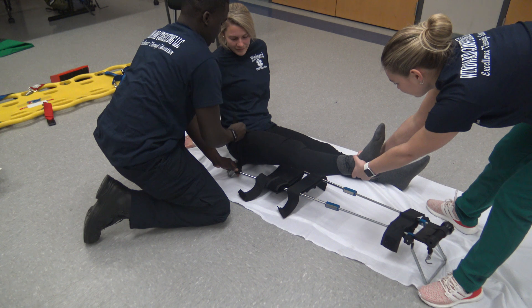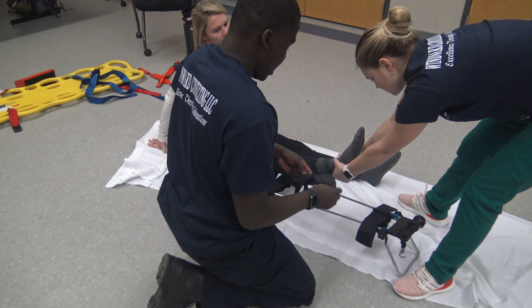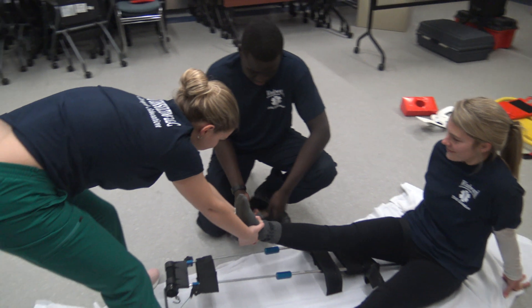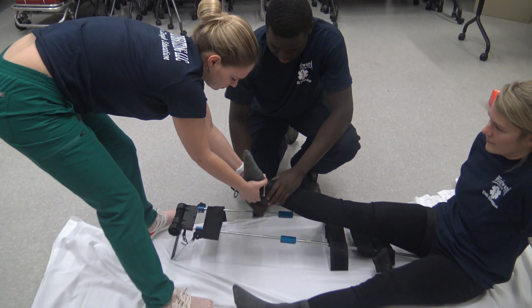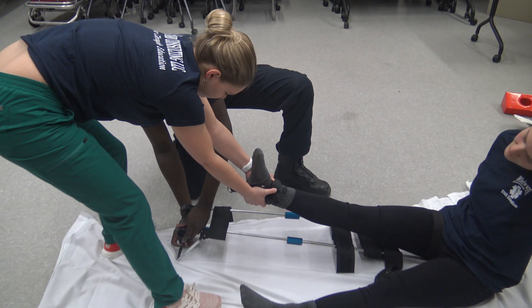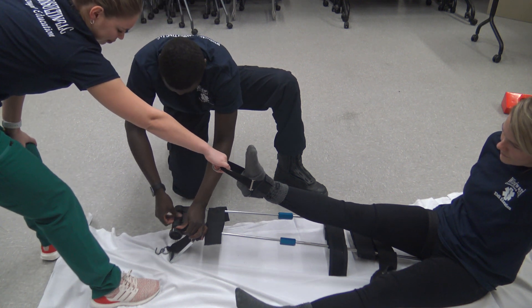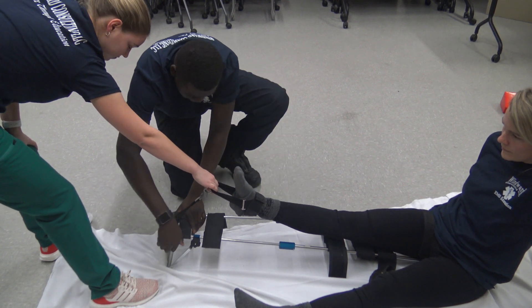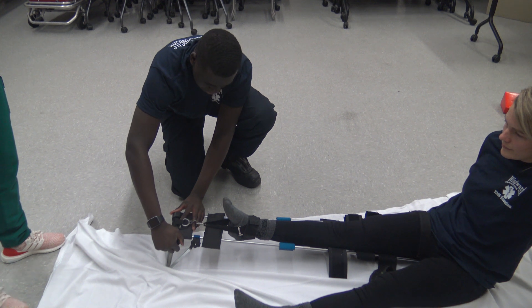I'm going to make sure that this strap is secure. I'm going to put the ankle hitch on. Now I'm going to tighten this until my patient feels relief and I'm going to go two clicks past that.